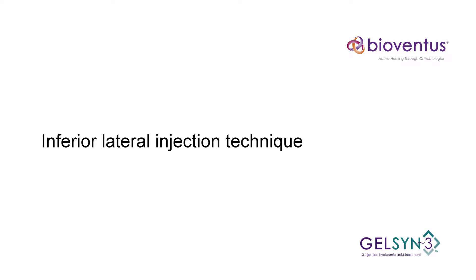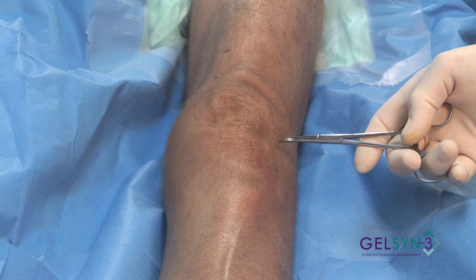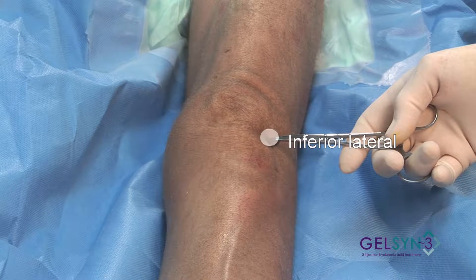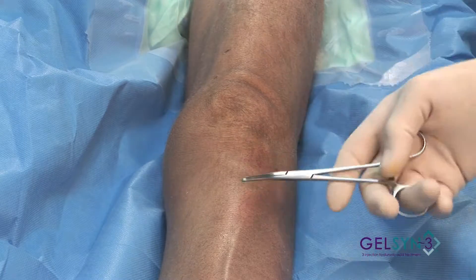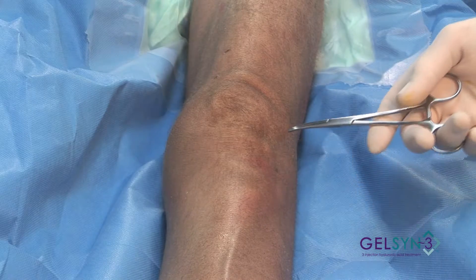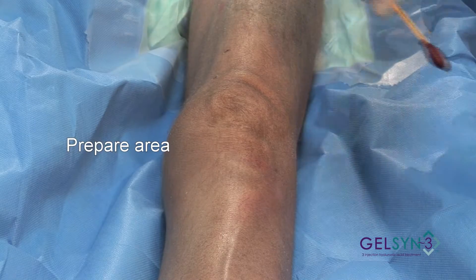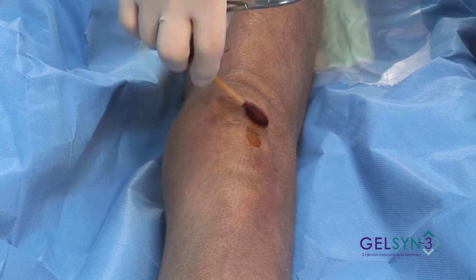Inferior Lateral Extended. We're now going to use the inferior lateral approach in the extended knee. Many people who use this inferior lateral approach actually begin with the knee flexed, but it is possible to perform this with the knee extended, and we'll demonstrate with the extended knee.